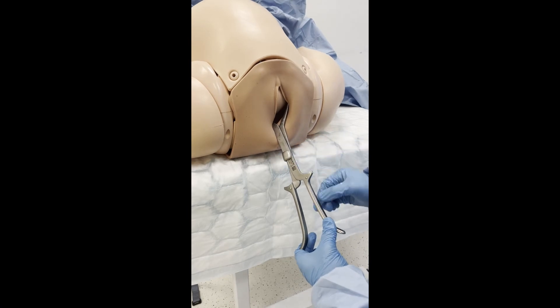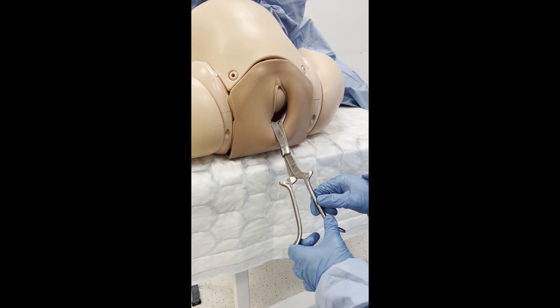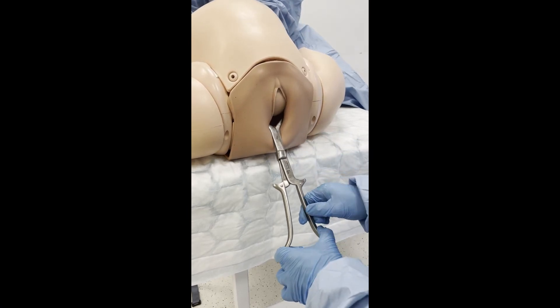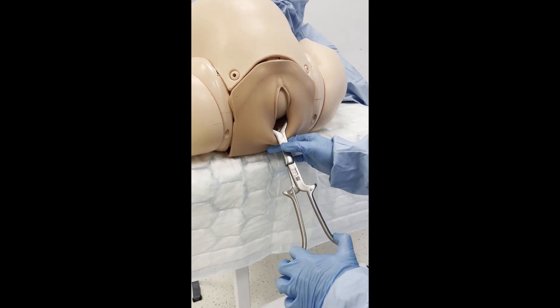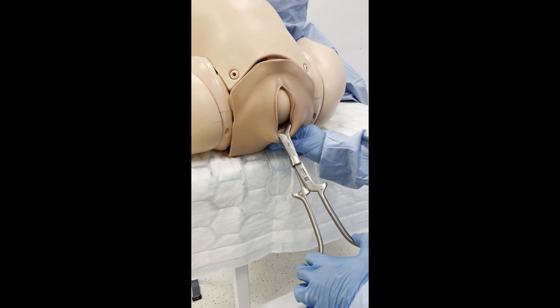The foetal head is now OA. The assistant will palpate for a contraction. When a contraction is present, apply traction in the direction to follow the pelvic curve, as with non-rotational forceps.